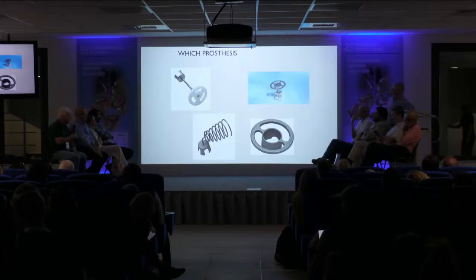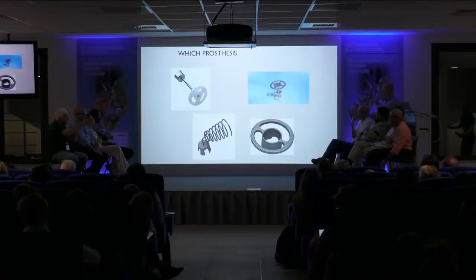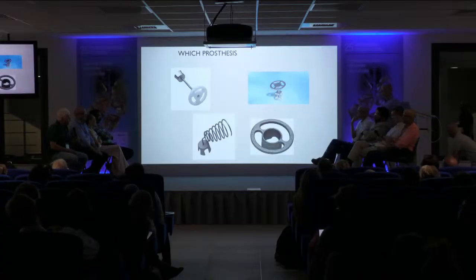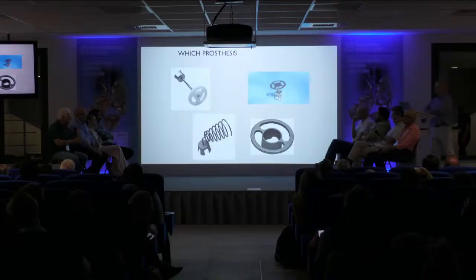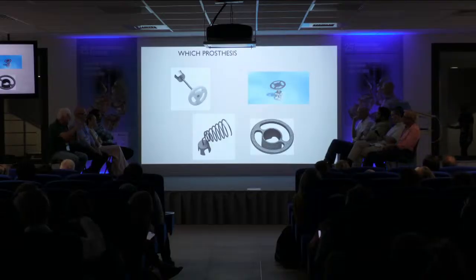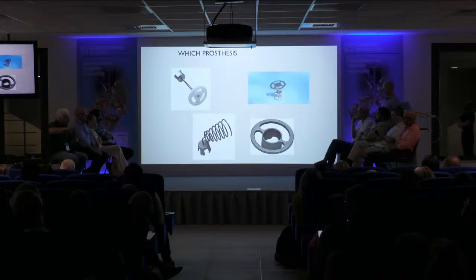So you've disappointed me here because I thought you were going to tell me about how you would carve a piece of calvarial bone into a prosthesis. Oh yeah, you can also do that. I like to do that basically when we're doing mastoid surgery, because then you have the whole cortical to do that. So we can carve, in situ carving the small prosthesis, and you can put on the top of the stapes, and even using as a TORP, you can use that. But you have to be very careful because this piece of bone has to be very delicate. You cannot touch wall structures with bone, because otherwise it becomes ossified and the results are not good.